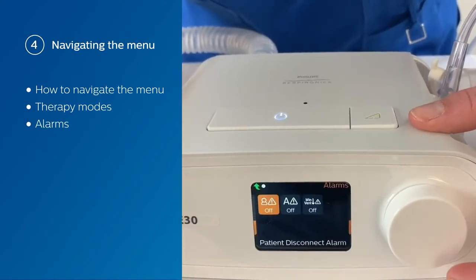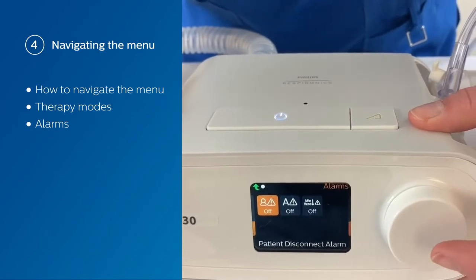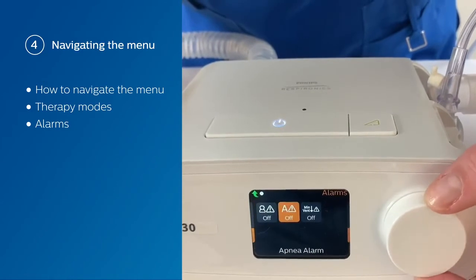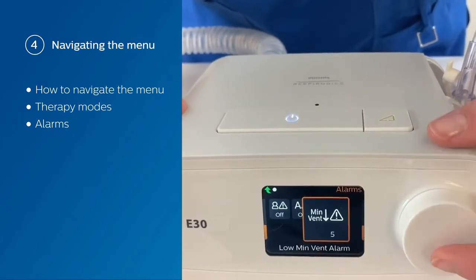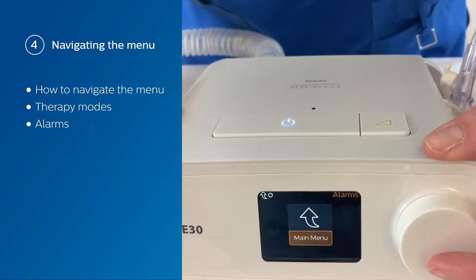There are three audible alarms that you can set, and they also have visual indicators. You've got the option for a patient disconnect alarm, an apnea alarm, and a low minute vent alarm. What we're going to do here is set our low minute ventilation alarm, then go back to our main menu.